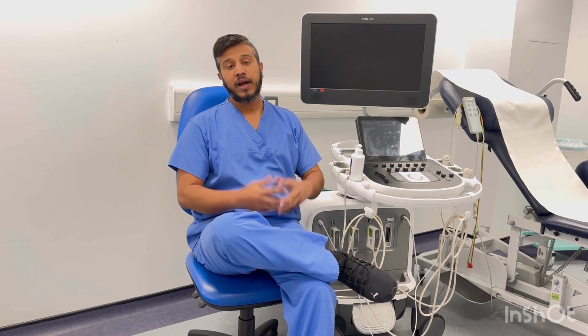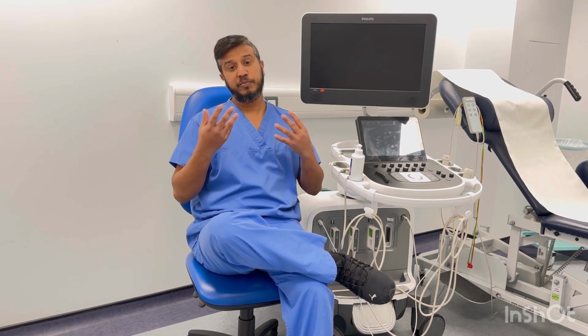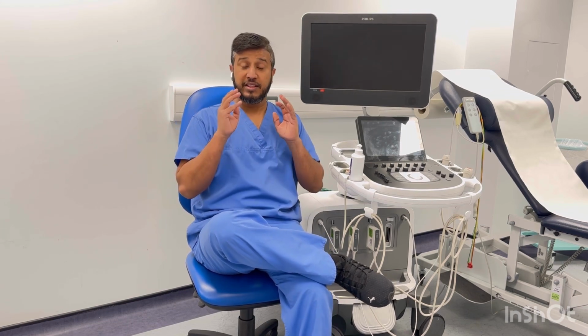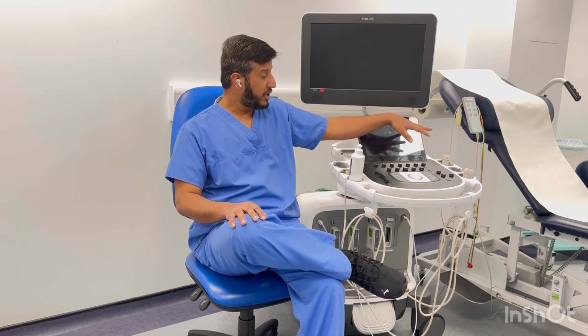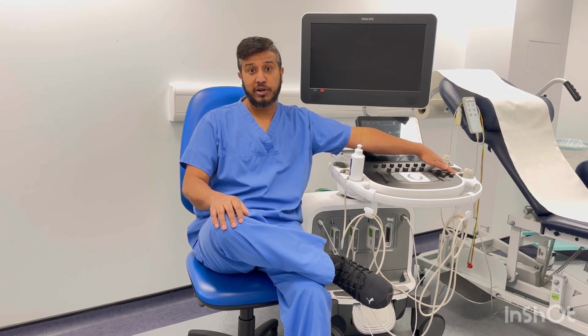Abdurrahim here with you. I hope you liked the previous videos, and I'm hoping that you already know the anatomy and the circulation of the heart. Now we will come on to the machines that, for example, you are going to start your imaging from today. So I'll tell you what are the important things you need to look for. The first and very important thing once you come in to do the imaging is to select a probe, like which probe you are going to ask.